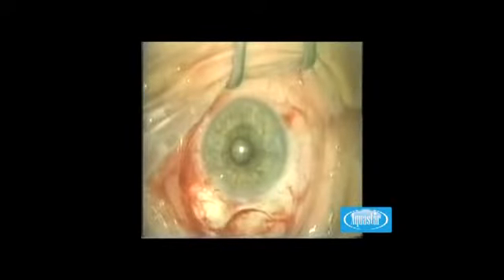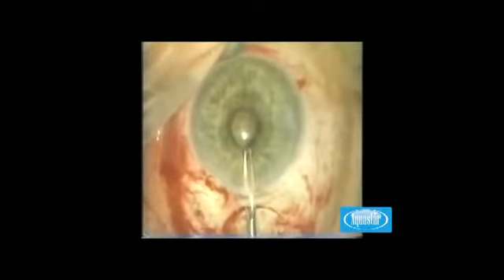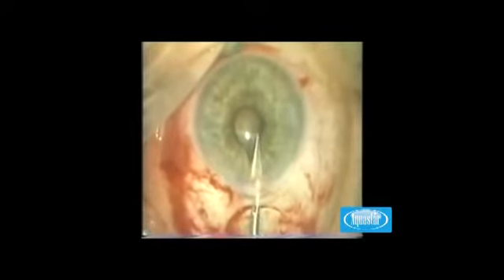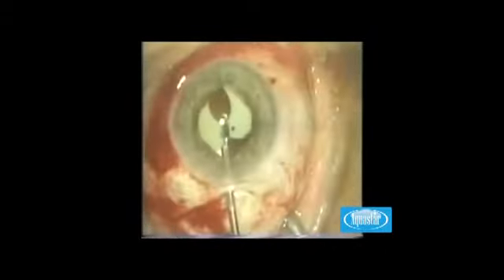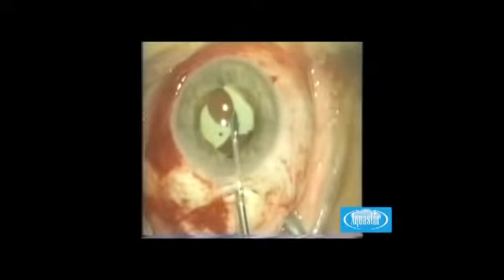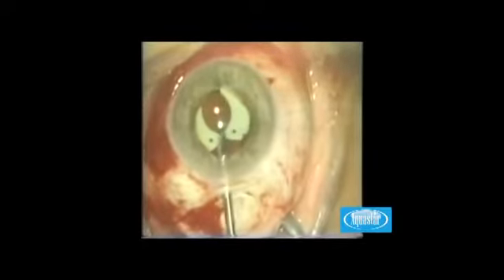The IPS double element can also be used for controlled phacoemulsification in extremely narrow pupils. At first, sphincterotomies or iridotomies permit visually controllable lens surgery. After the posterior chamber lens implantation, the iatrogenic iris incisions are covered by a double element with a narrow design.